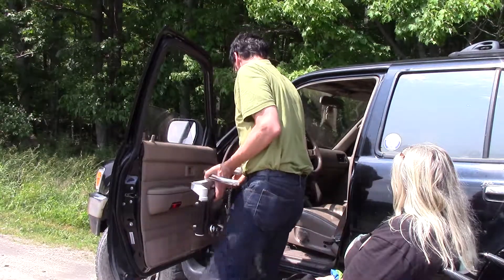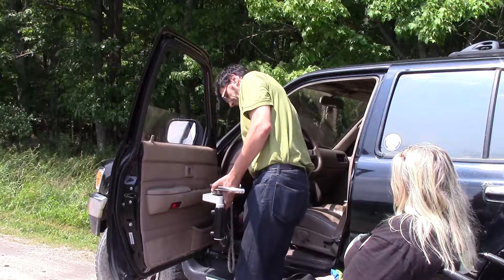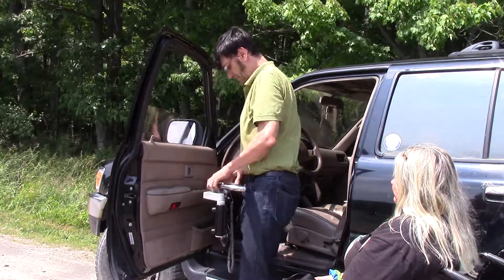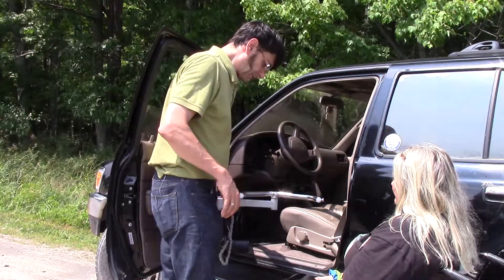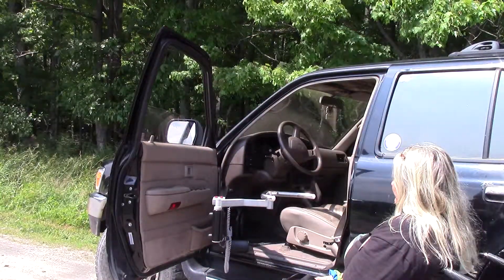Next, we place the Multilift on the mount. We're ready to go. We're going to put the Multilift to the down position, move the wheelchair in place, and we're ready to lift.